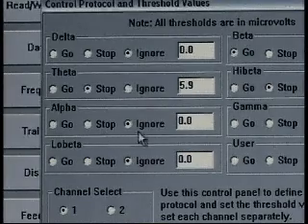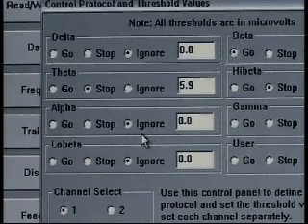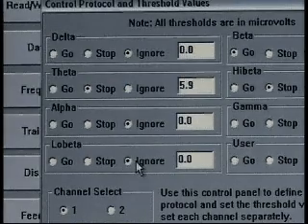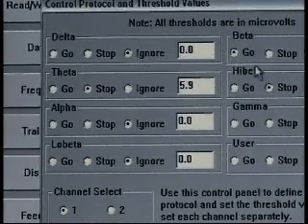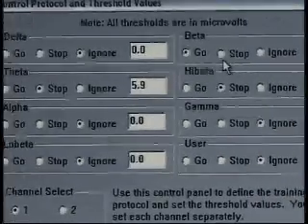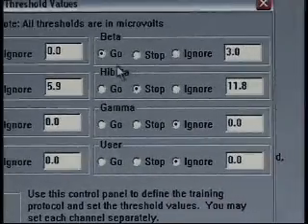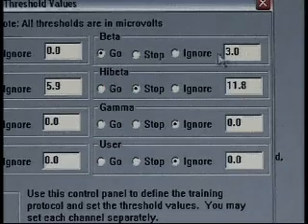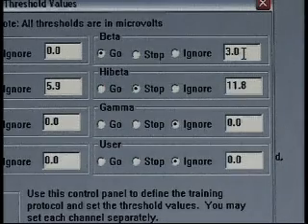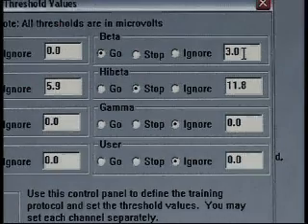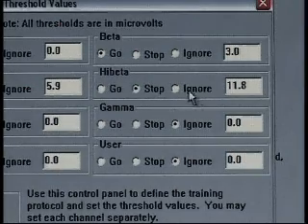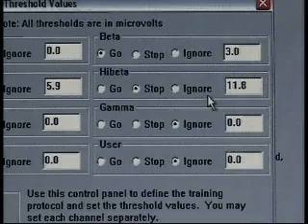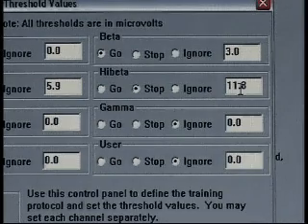As we scroll down to the next item, it's alpha. We see that's on ignore. Low beta is also on ignore. As we go up to the upper right hand side, we notice that beta is a go or a reward. Again, we see 3.0, not representing any Hertz or bandwidth. This just happened to be where the threshold ended last session. High beta happens to also be a stop or an inhibit, and again that threshold was 11.8.